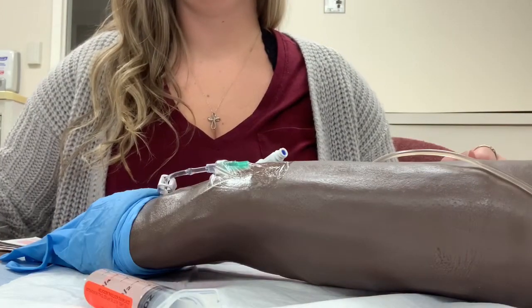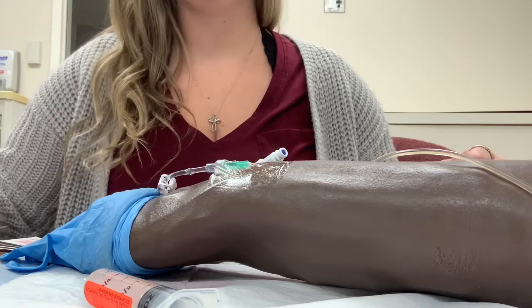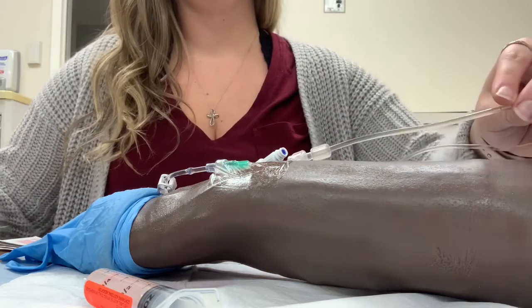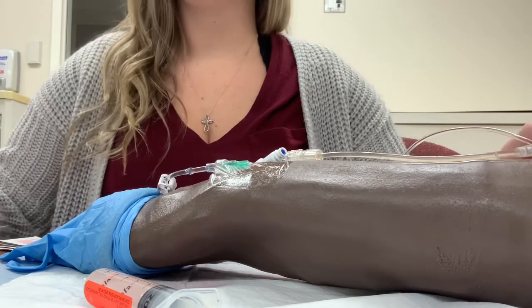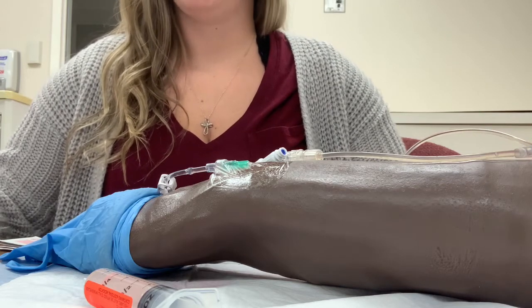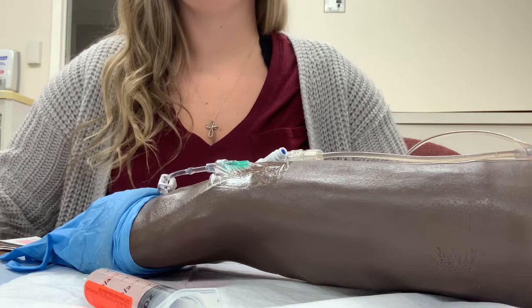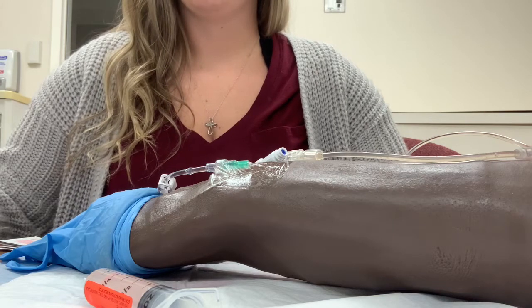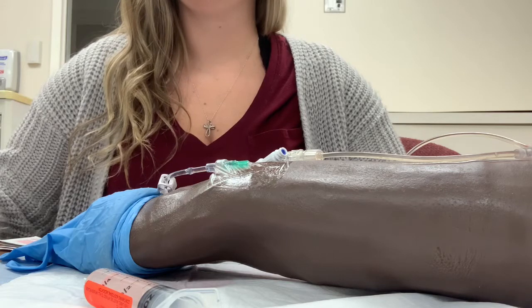For the second flush with the incompatibility method where the IV line remains connected, I would flush at the same rate that I administered the medication — so 2.5 milliliters every 15 seconds over a two-minute time frame.